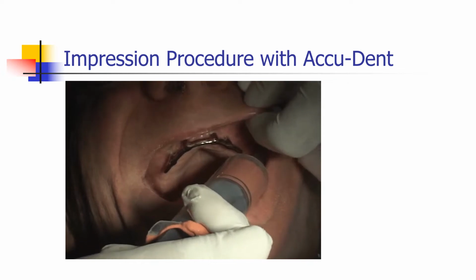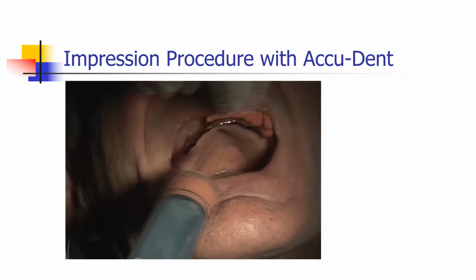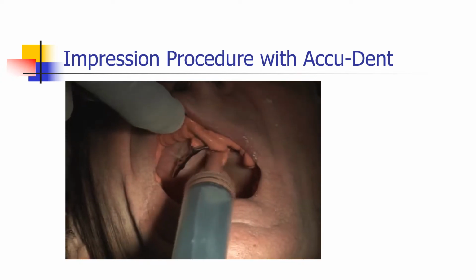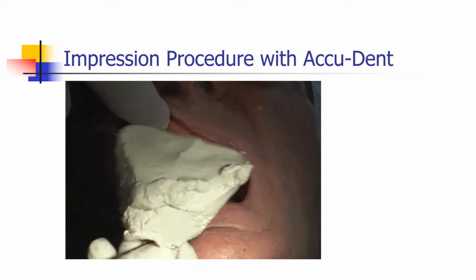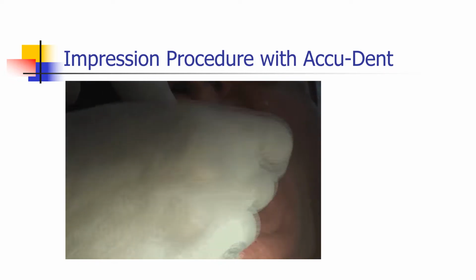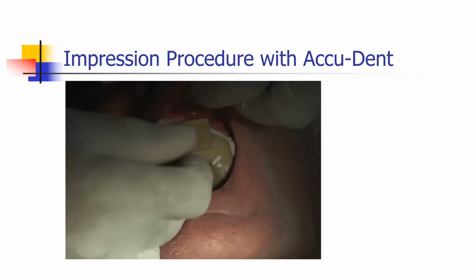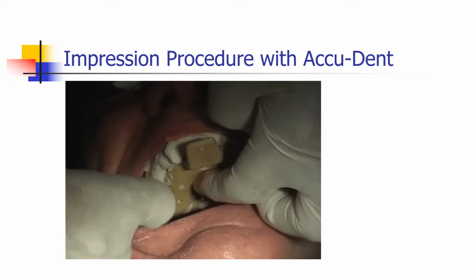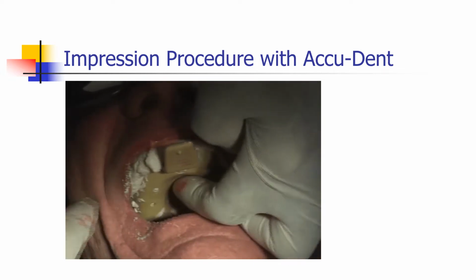You see that? We're going to syringe it into the material all the way back to the buccal. Just have the patient relax his lips a little bit into the palate, and then we take the heavy body and we start it from the front. Relax your lips, let your lips relax, and just watch the roll go up into that buccal fold, and just gently seat it and just roll that material over.